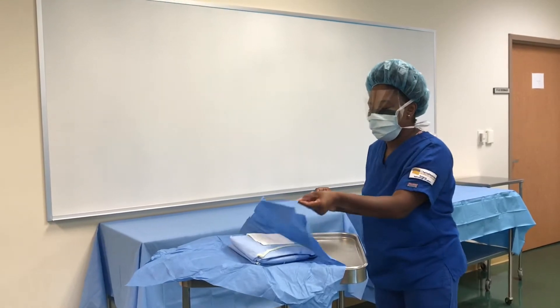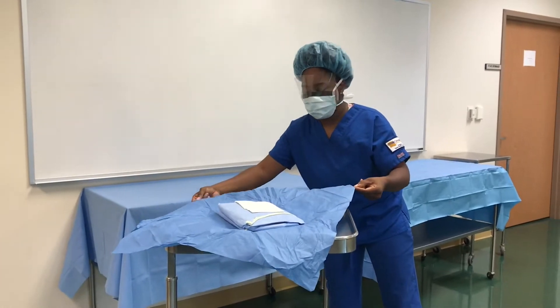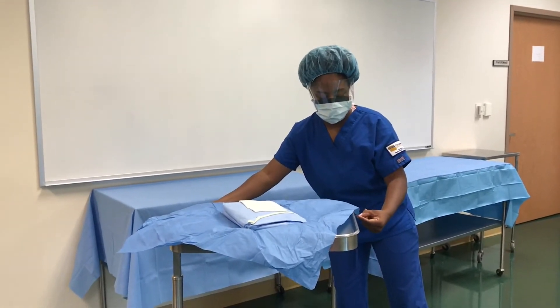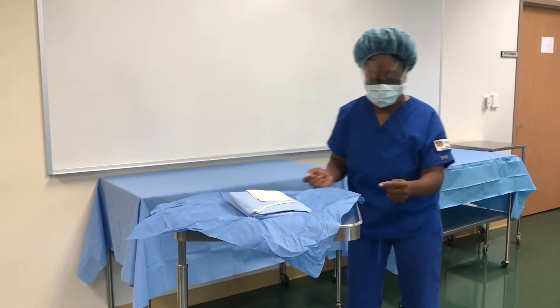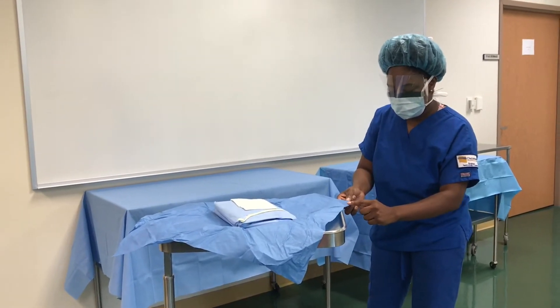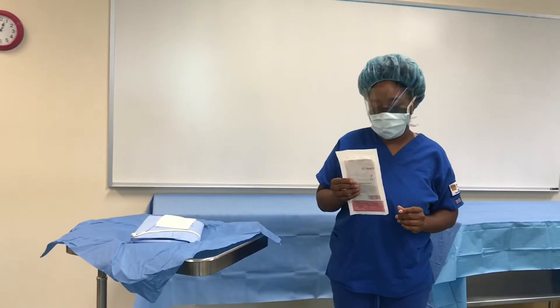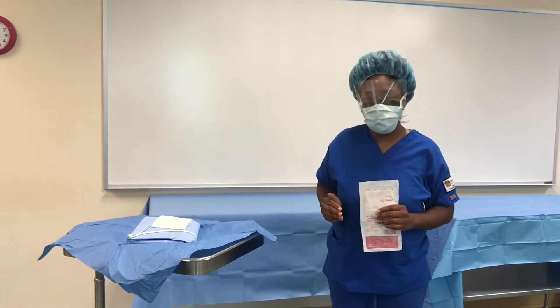After that I pull this, and you have to watch out for some of these corners because some corners will fold back up — you want to catch it and bring it back down. Try to be careful and stay within the one-inch mark of this towel right here. When opening up your gloves, you want to make sure you have maintained your sterile field.